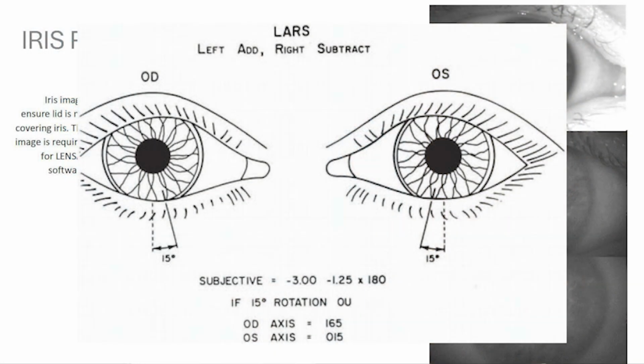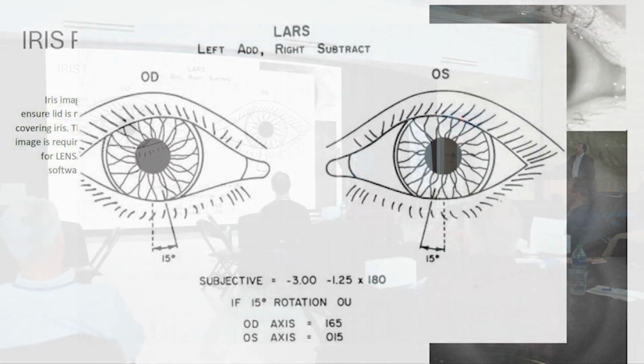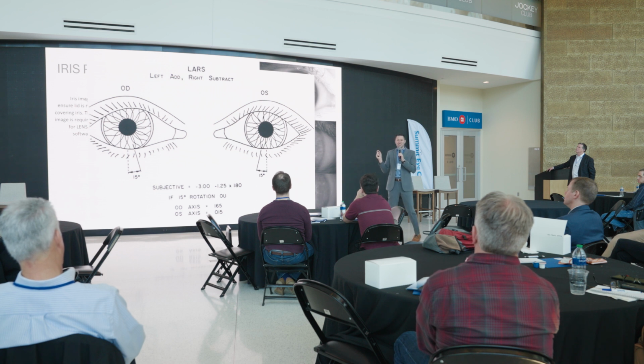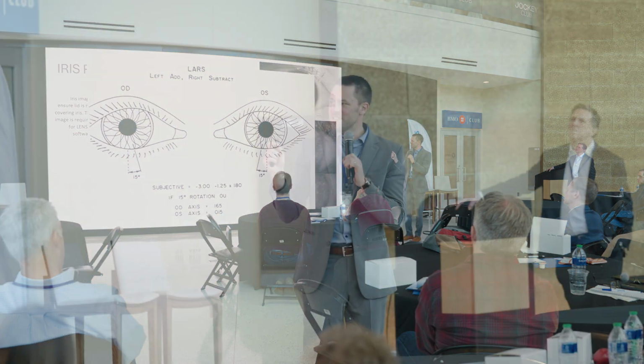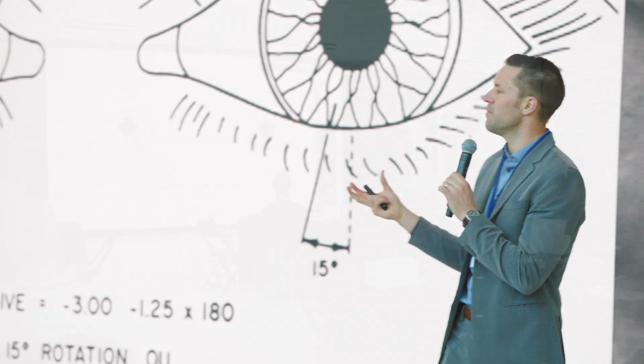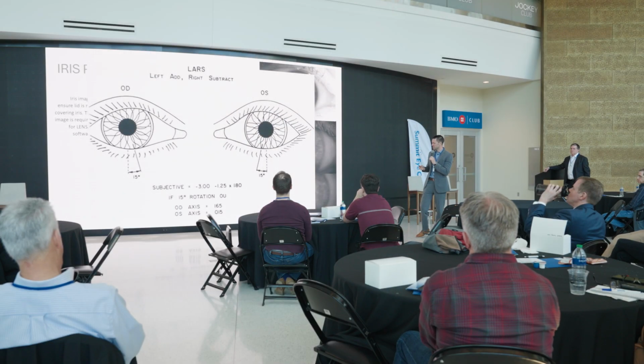Now, we all know as optometrists the LARS rule, right? We learned this in our contact lens classes. If you put a contact lens on the cornea and it rotates by 5 degrees, well, number one, that patient's probably not thrilled with their contact lenses. How do we deal with that? Well, we add 5 degrees to the prescription to compensate. It's not that easy in surgery. If you're off 5 degrees, that patient is unhappy. How do we fix it? Well, you're looking at more surgery. We need to be more accurate in the operating room. And that's how we accomplish it. Now we have the iris registration technology that helps us compensate for those variables in the operating suite.